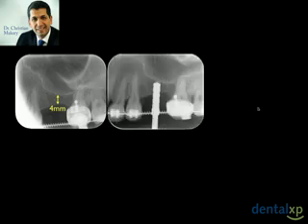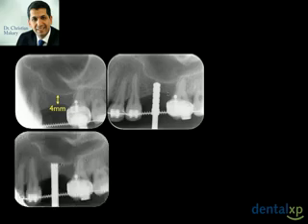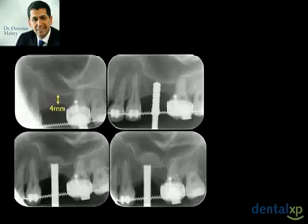In that other case, I had 4 millimeter. And here also, by drilling until we reach, as we said at the beginning of the lecture, the floor of the sinus, you see that there is always a protective part that is something like 0.5 millimeter or 1 millimeter of bone. By the use of an osteotome with some biomaterial added, we broke that floor of the sinus, and this is the dome-like effect of the biomaterial that is going smoothly inside. You can see now the huge amount of bone that I have inside the sinus.